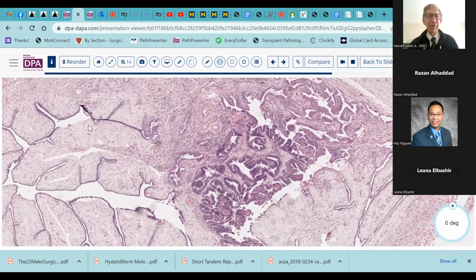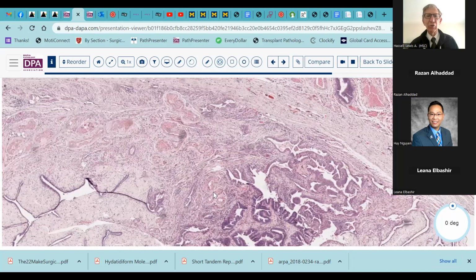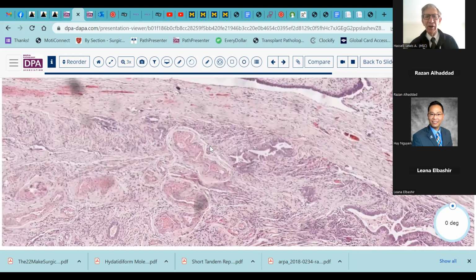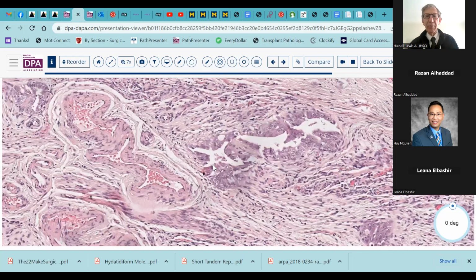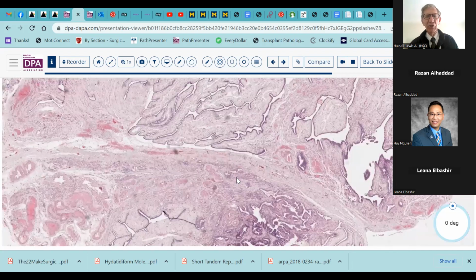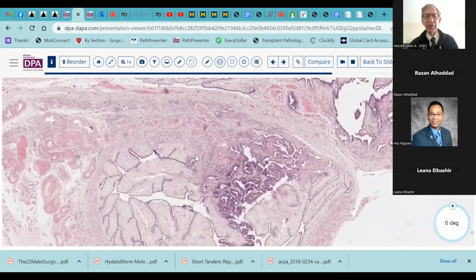But you do have this baseline appearance of what this patient's normal fallopian tube and stroma looked like. And here you have changes in both the epithelium and in the stroma, as well as close approximation to vessels, as you can see here, and probably some extension here into these spaces. So accepting that this type of invasion in this sort of case could have been due to just disseminated intraperitoneal disease, the presence of this type and pattern of invasion from this type of tumor is certainly acknowledgeable or possible.